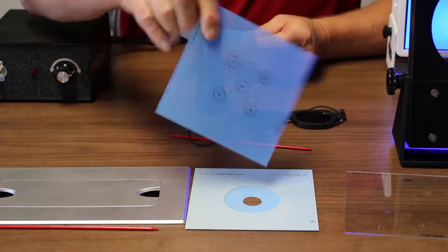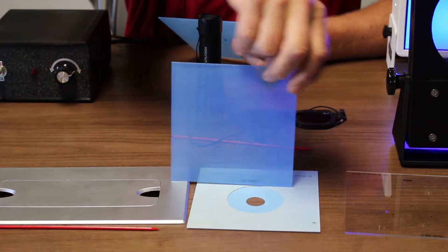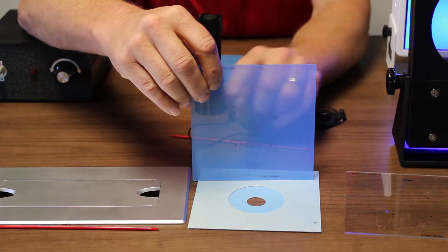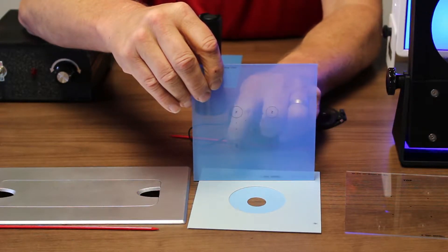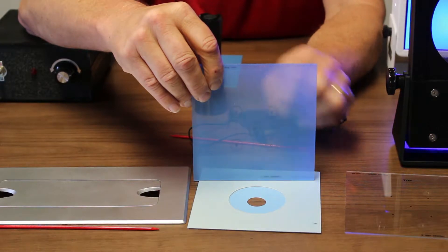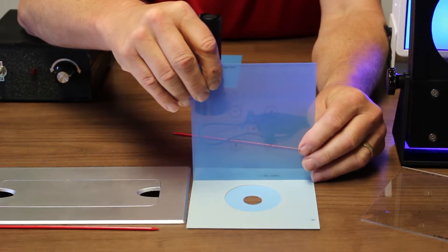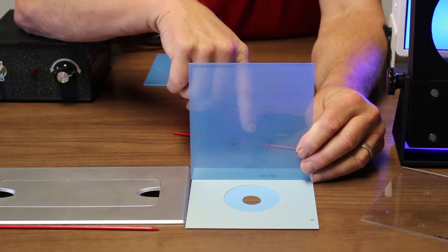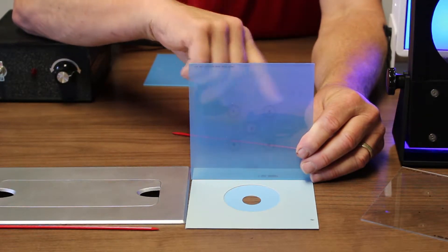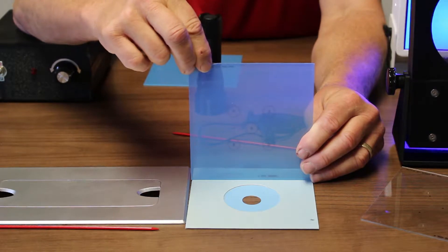I'll get it forward for you. You would again go from the F to each dot to the Z down and back and forth and moving all around. The goal is to, each time they move their eye, to be picking up the next dot or letter with the fovea and having that propeller spin exactly around those.